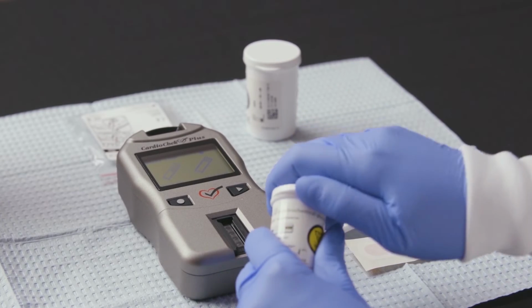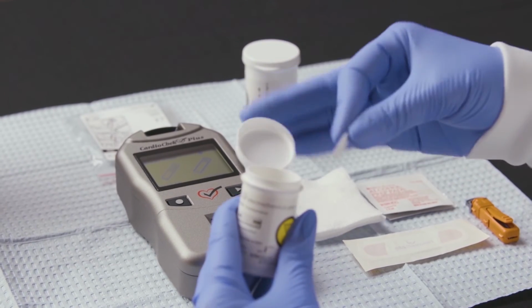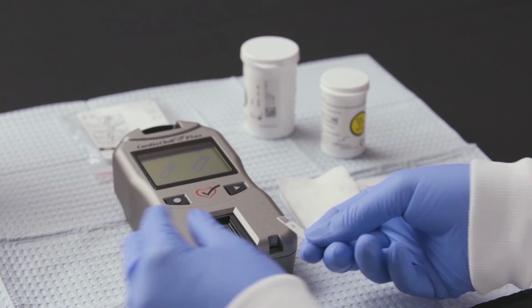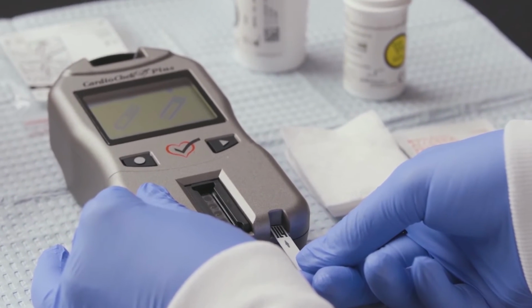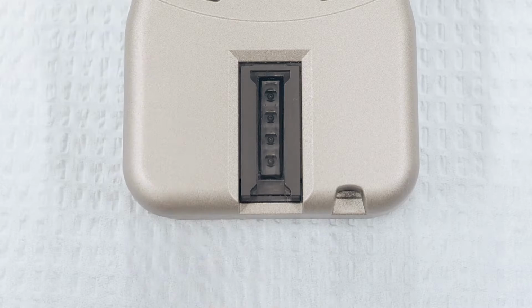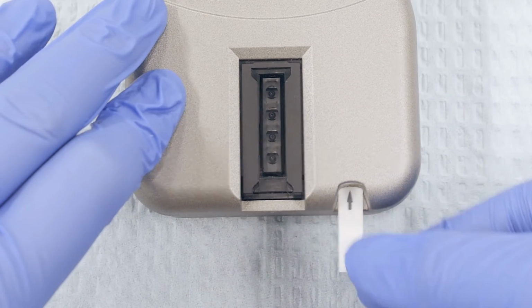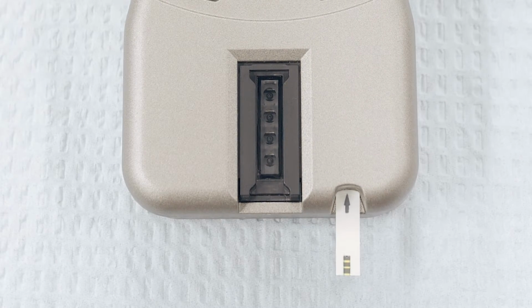Remove one eGLU test strip from the vial and immediately replace the lid. Hold the test strip with the arrow pointing toward the analyzer. Insert the strip into the electrochemical test strip port. Gently push the test strip into the port as far as it will go.